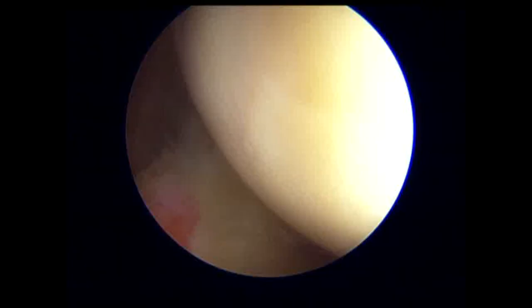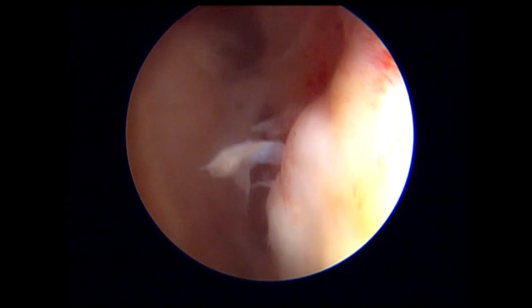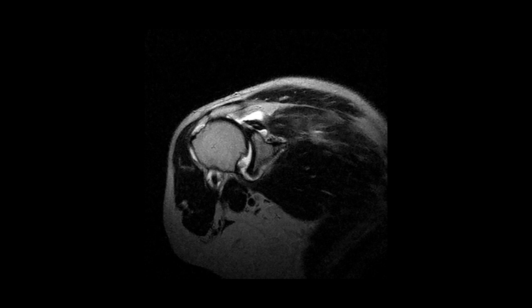This is a massive tear of the supraspinatus and infraspinatus, with retraction medial to the glenoid, with extensive loss of footprint attachment at the greater tuberosity. Coronal MRI image depicts the extent of tear. The pivot point is highlighted, which will be the point about which the anatomic relationship of the rotator cuff tendons will be restored.